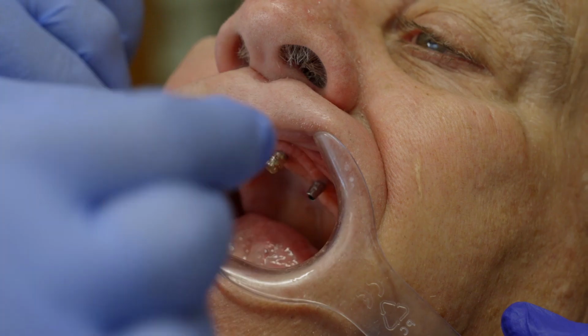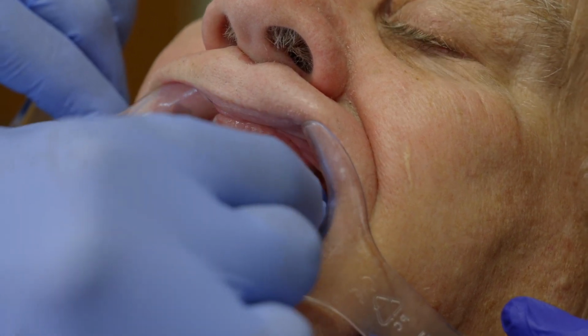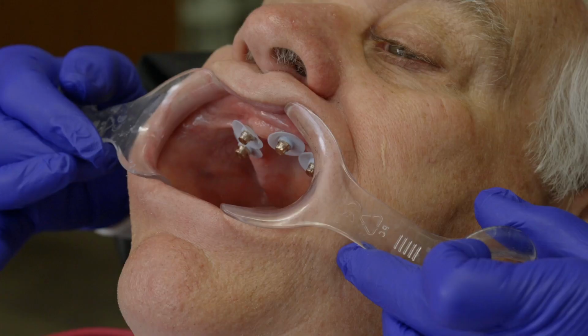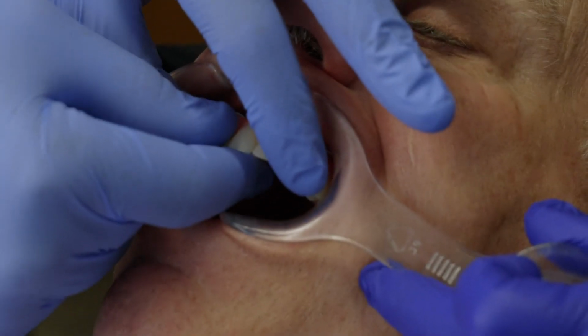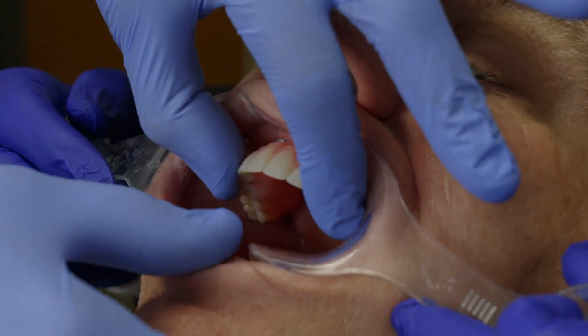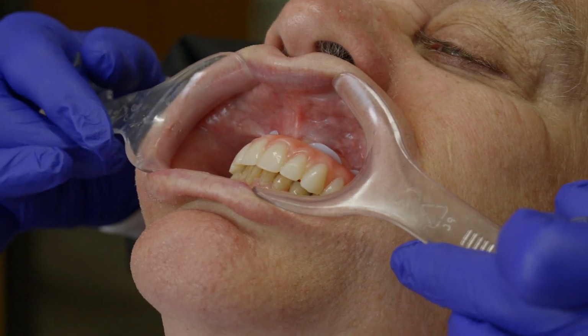Conus is, I think, a very underutilized restoration with such tremendous advantages. One of the biggest problems we have today in implant dentistry, especially for full arch restorations, is peri-implantitis and peri-implant mucositis. One of the reasons is that, especially in the upper arch, we try to get the aesthetics at the detriment of the tissue. So we have to close things up. While it may look good for a while, we're making it impossible for the patient to keep it clean. Yet patients want to have something permanent.